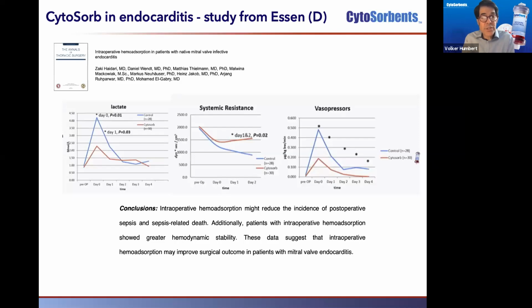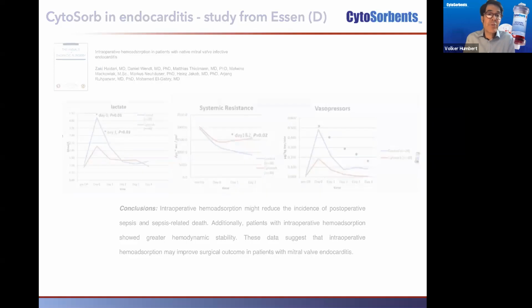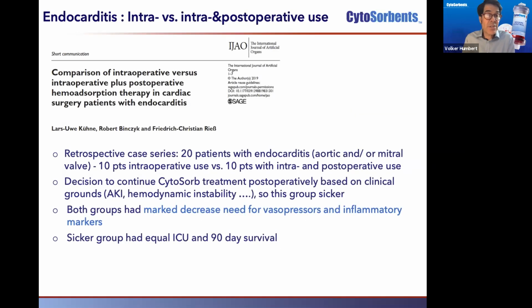There's one kind of still open question, and this is, should I continue Cytosorb therapy after surgery? So should I continue my intraoperatively started Cytosorb treatment postoperatively on the ICU? And to try to answer this question, at least as a first step, there was a nice comparison done from a recent publication in Germany. They took 20 patients with endocarditis and had 10 patients that were treated only intraoperatively and compared those with 10 patients who were also treated postoperatively, so as well.